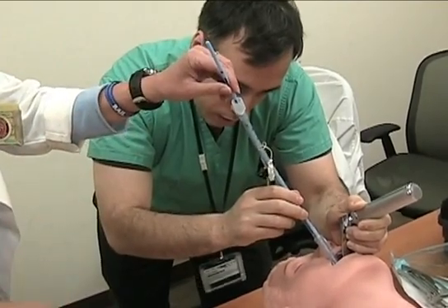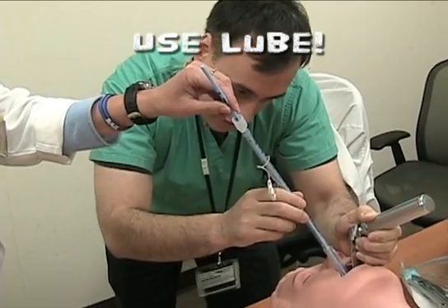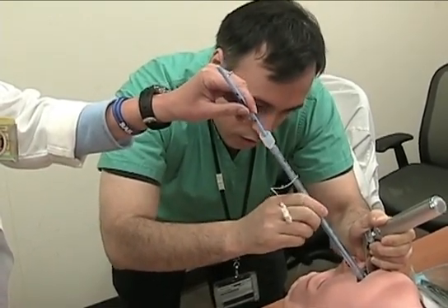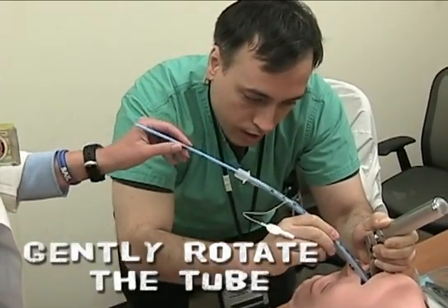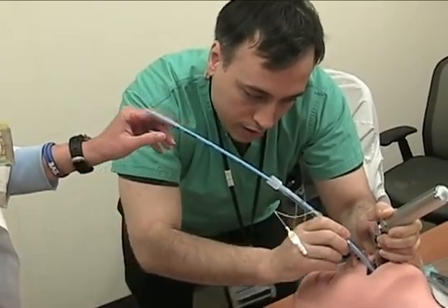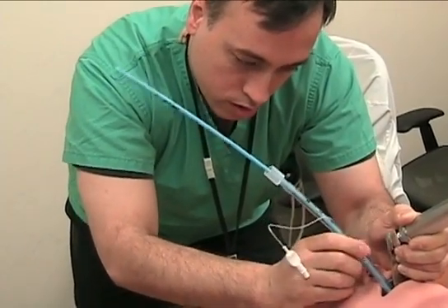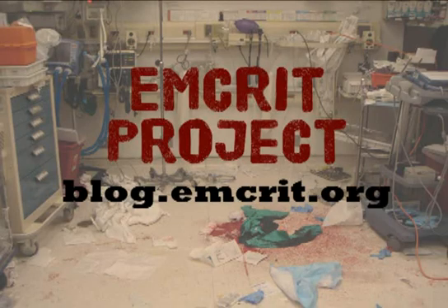Have an assistant place the tube over the bougie and hold the top of the bougie — this allows you to advance the endotracheal tube through the cords. Given the shape of the endotracheal tube, oftentimes it'll hold up on some of the cartilage or get caught on the cords. What you want to do is rotate the tube counterclockwise 90 degrees, then gently go back and forth and rotate ever so slightly, and eventually the tube will pass. As long as you're gentle, you're not going to cause any airway trauma — if you try to jam it in, that's when you run into problems. Eventually the tube will start passing; go to about 22 or 23 centimeters, take out your laryngoscope, take out your bougie, and confirm your endotracheal tube.